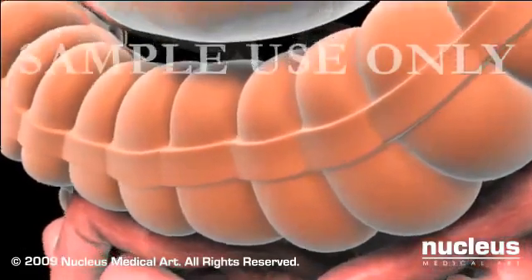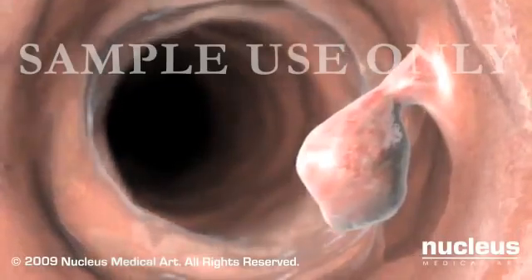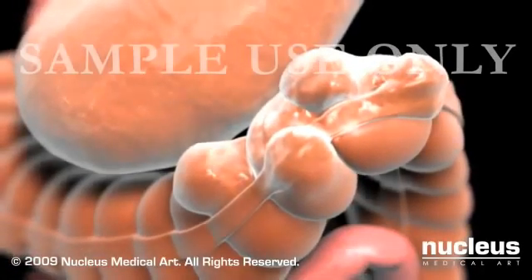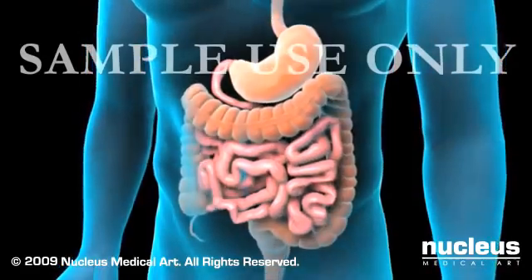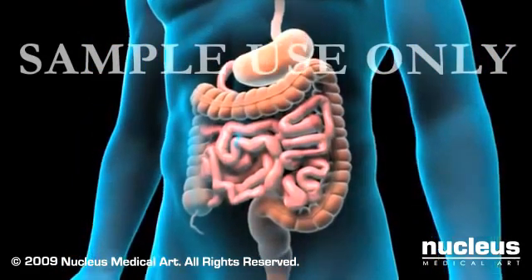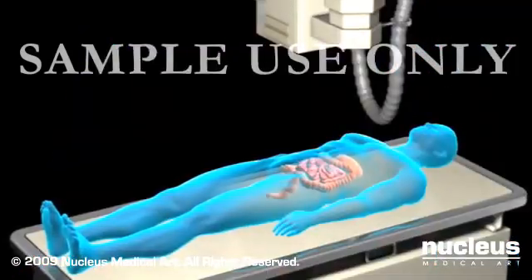Abnormal conditions may develop in your colon, such as colon cancer, polyps, out-pouchings of the colon wall called diverticula, ulcers, or narrowed areas known as strictures. If you develop unexplained bleeding, abdominal pain, or change in your bowel habits, your doctor may recommend you get a barium enema examination.